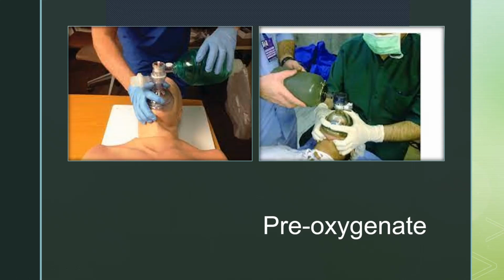Because when a patient goes limp, all of this falls back, and it starts obstructing the airway. Pull it forward, and because of the attachments of the tongue, it pulls the tongue forward as well and opens up the airway. That's why we do that. You can see even on the two-handed one, they're doing a double EC. It's for the same principle. You're just trying to pull it up. And then the C is to try and maintain balance on the mask itself. You're holding the top and the bottom in place because you don't want any leaks.